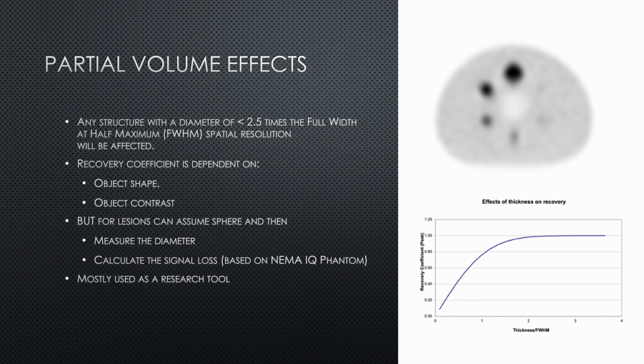This type of approach is mostly used as a research tool, but there are a number of other methods out there, and I'd like to point you to this paper by one of my team a few years ago if you want to look at how to measure the partial volume effect and how to correct for it.